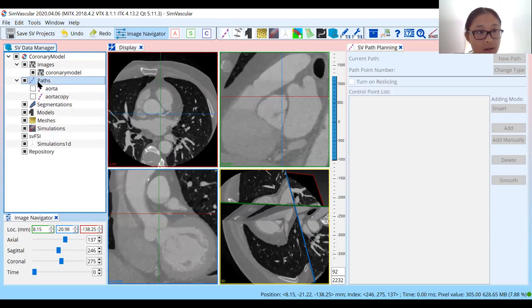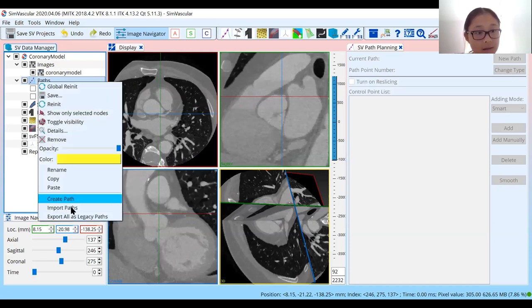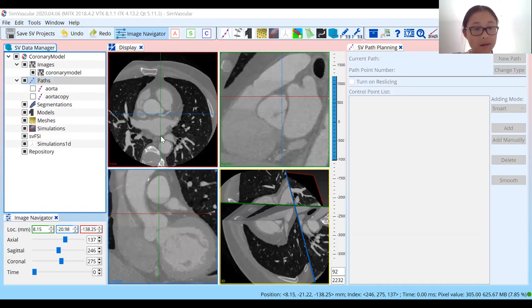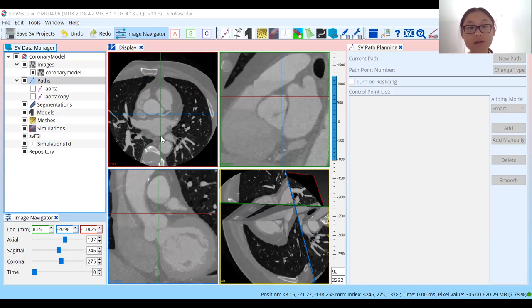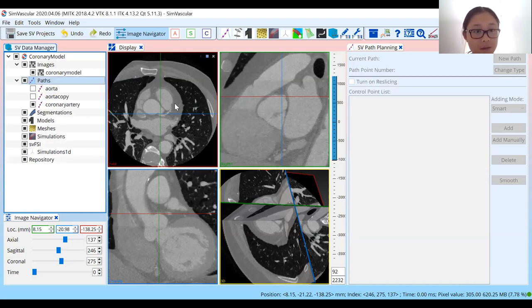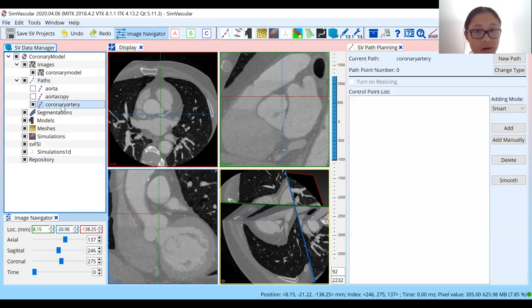Just like we did last time, right-click on paths and create path. You can name this "coronary artery" for now. Once we figure out which one it is — left or right — we can change the name pretty easily. Make sure that you've selected the coronary artery path, since we don't have any points yet. We can then add a point.